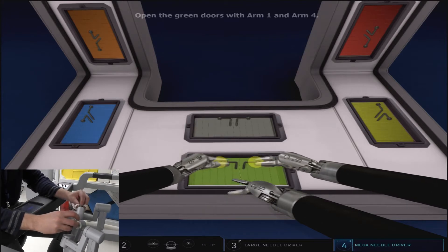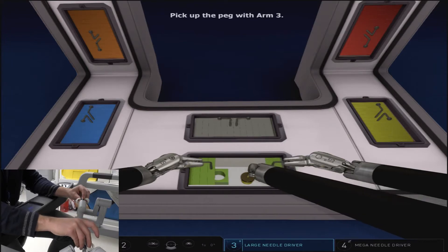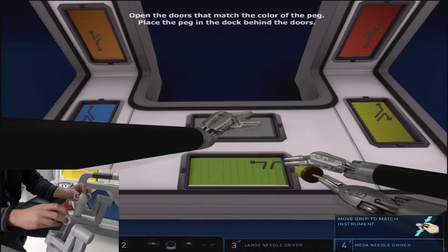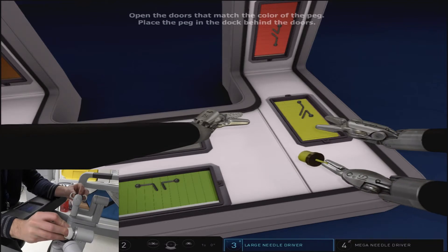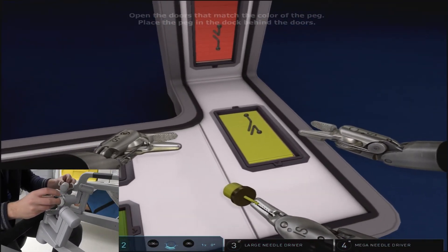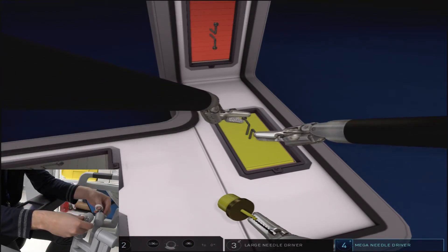Additionally, the shapes and placement of panels is randomly generated and the order is not always the same as you go through each attempt. We're sticking with the coordination of movements where the outer left and outer right arms are doing the door opening and the middle arm is performing the removal and placement of the designated shape.